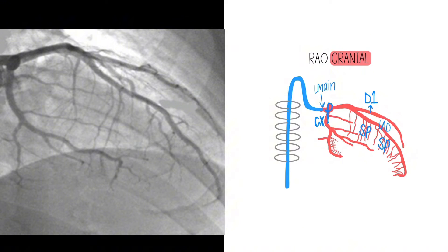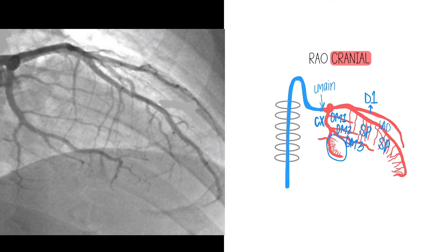The septal perforators are heading toward the septal and lateral wall direction, so all of these are septal perforators. That means this must be a diagonal or D1, because there is only one diagonal here. This is the circ — remember the proximal segment is kind of curled and overlapped up here, so we can't separate that out very well. In this view: this is OM1, OM2, this is either a PL or OM3, and then this one has septal perforators making it the PDA, with the distal circ segment going into the AV groove.